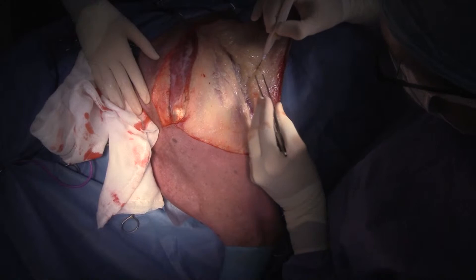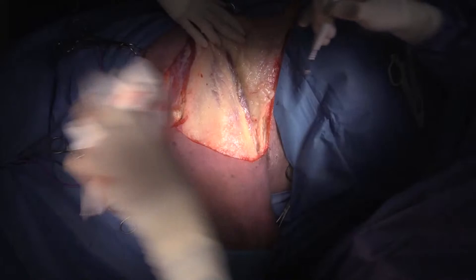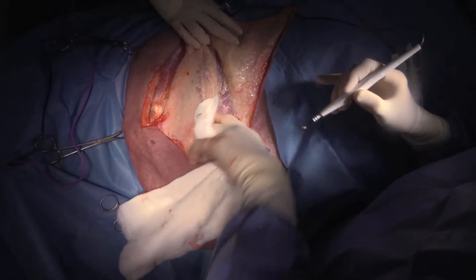So the lateral thoracic vessel will be in here somewhere. This is the latissimus dorsi muscle right here — that's the aponeurosis of the latissimus dorsi muscle. If you can cut through the aponeurosis, it's a little bit less painful and they bleed less.